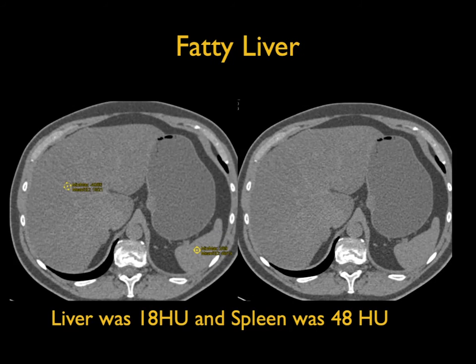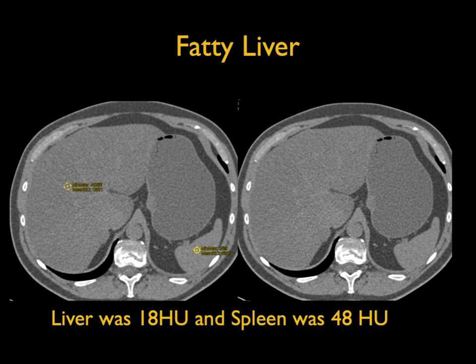Here's a nice example of fatty infiltration of the liver. The patient also has textural change with a prominent caudate lobe. Using a one-centimeter circle for measurement, the liver was 18 Hounsfield units and the spleen was 48. This is surely fatty infiltration of the liver — non-contrast under 40 is fatty infiltration, and the liver is also less dense than the spleen by more than 10 Hounsfield units.